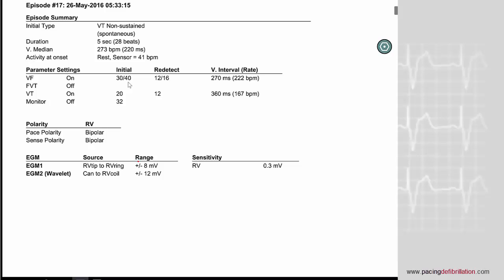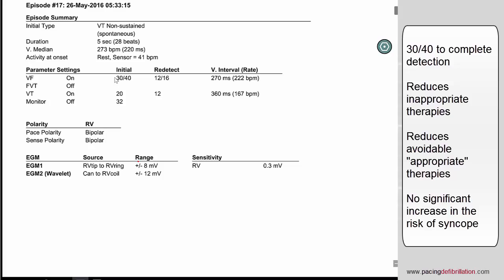This is a very good example to demonstrate the interest of this kind of recommendation. Prolonging and increasing the number of cycles for initial detection can help decrease the amount of inappropriate therapy in cases of lead failure or SVT, but as in this example, can also considerably decrease the amount of appropriate but avoidable therapy. This is a main priority of programming: you need to try to decrease as much as possible the amount of inappropriate but also avoidable therapy.